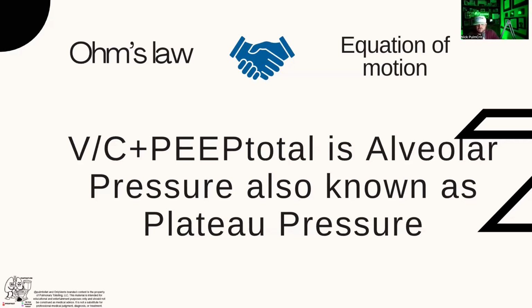This is where all these terms get confusing. But if you're getting a certain volume with a PEEP of 5 and a delta pressure of 15, going to 20, and then there's auto PEEP, now instead of going from 5 to 20, you go from 10 to 20. With less of a delta, you're going to get less of a gradient and ultimately less of a volume. So this is what we think about when the compliance goes down: you need a higher delta pressure to drive in the same amount of volume.